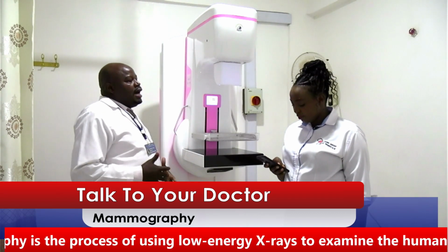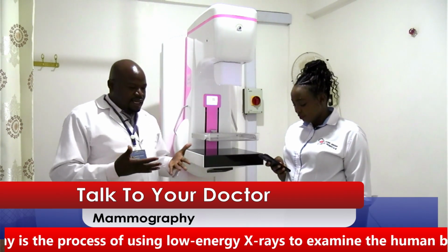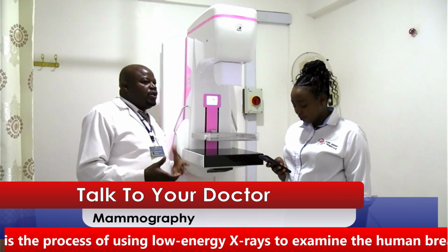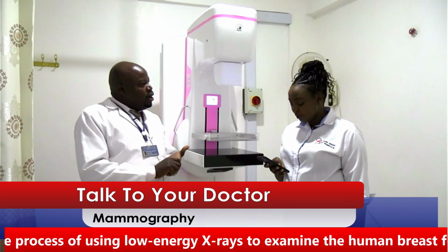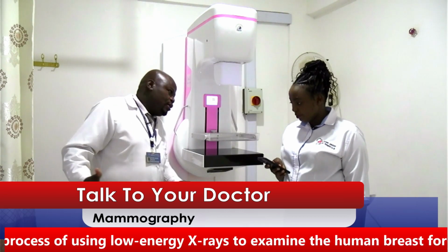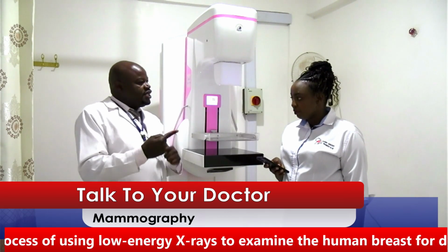Maybe after treatment, maybe after therapy, we want to know whether the mass has completely healed, has completely gone, or it has even grown bigger. Whether there is a positive response.